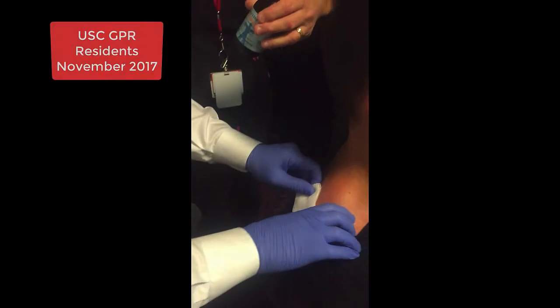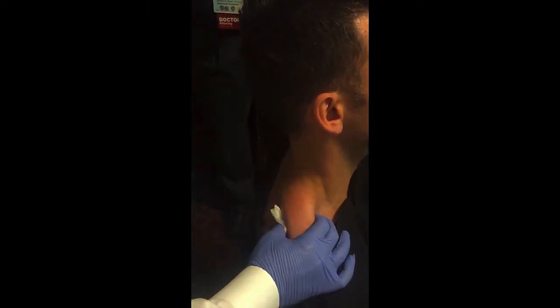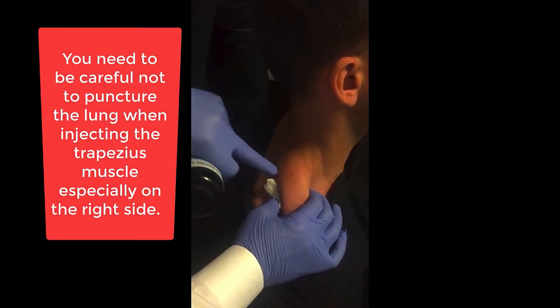So this is what I do for patients. You're going to hear me say cold, and then you're going to hear me say poke. I want to grab this up, and I know I'm 100% going to be in the muscle, and I'm going to stay perpendicular. I'm not going to go down.